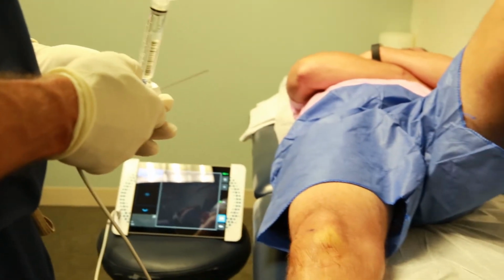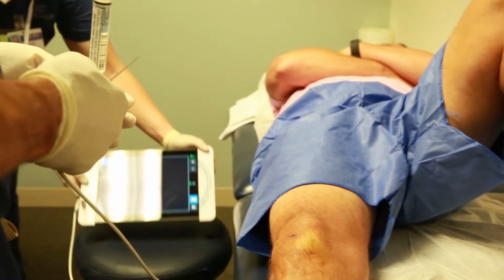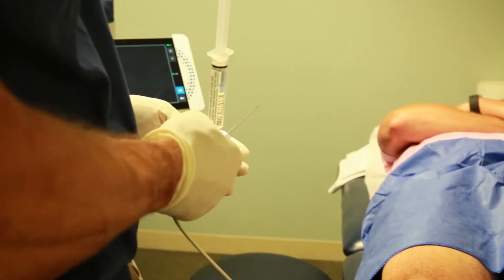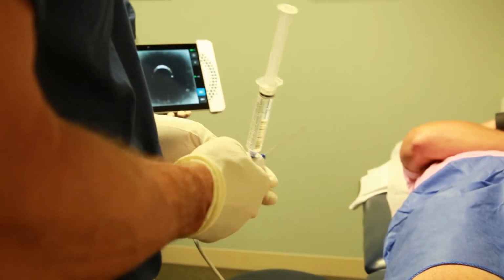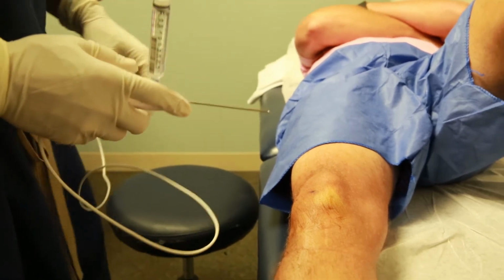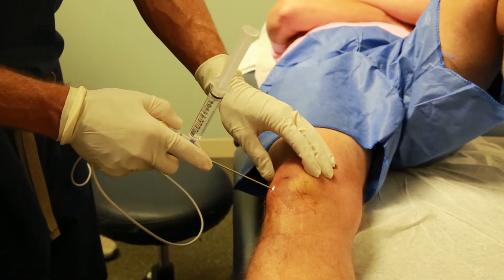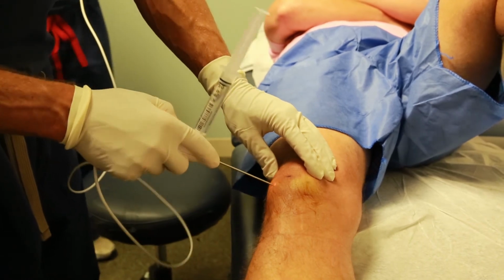So we'll take a look and make sure we're able to see and we have a good picture. And then we retract it and we're ready to go. Now my right hand is my sterile hand, and we're going to go, just let your patient know what you're doing.